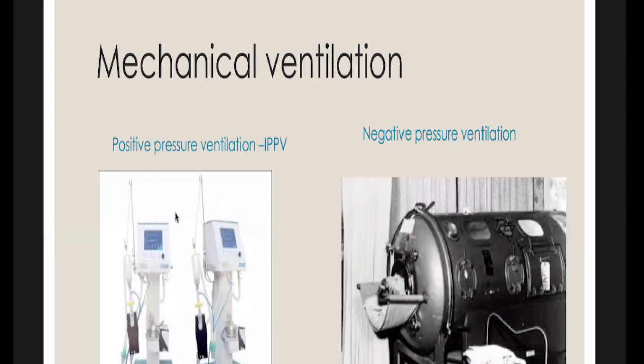Whatever is done by the nose and the upper airway, such as humidifying and warming of inspired air, is done by these instruments in an artificial way. So this is used for mechanical ventilation. This is for positive pressure ventilation, where we produce a positive pressure through a patent airway, and the machine delivers a flow that will reach the lungs.